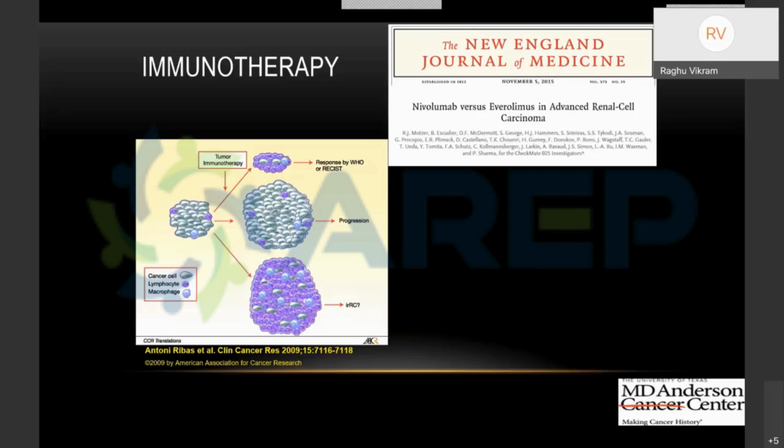And you don't even know how long I have to keep them imaged for, right? Exactly. What you're looking for is, in the slide that I showed, we know that they are all renal cell carcinomas, or maybe most of them are. They don't grow that much. And so too frequent is also tough, but you don't want to sit on something which might metastasize, right? Or if it's growing, then you get nervous. So it is a little bit of a wait and watch policy. Thank you so much.